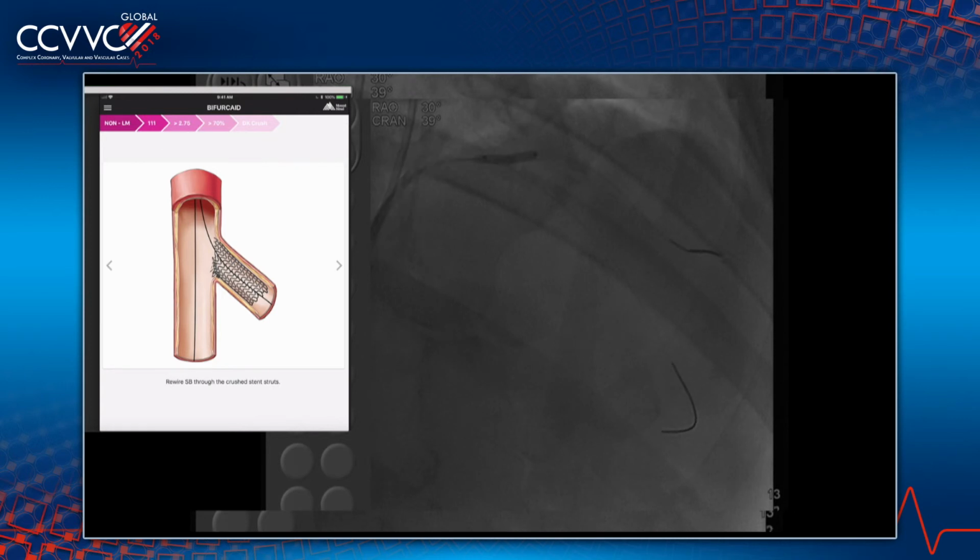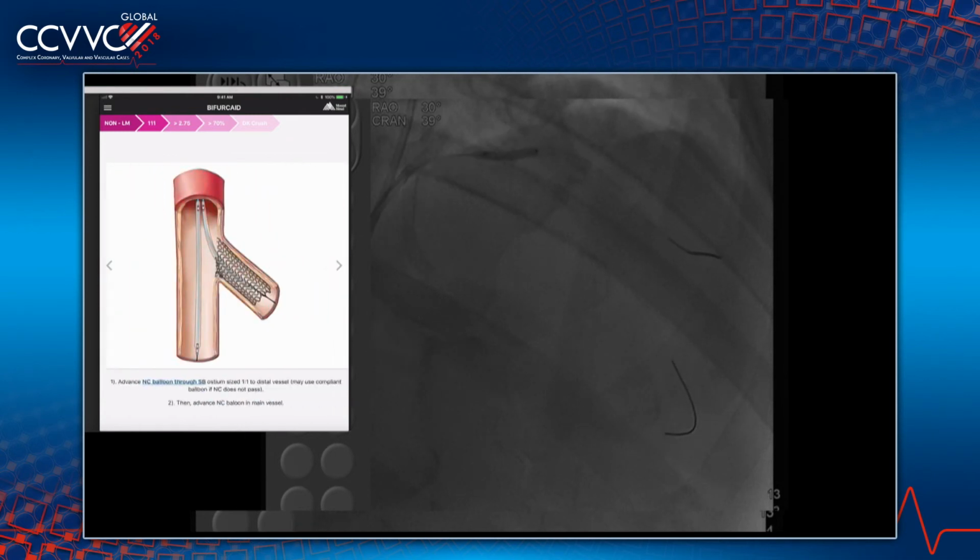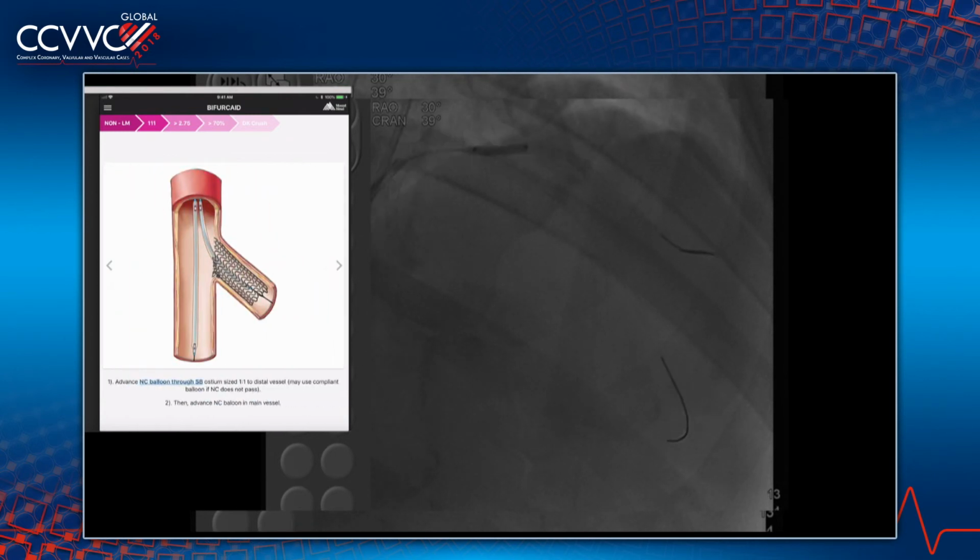So the key issue is you have to do POT at the end. Now we have to kiss, right? Yeah, but at the end, don't forget the POT. I mean, everybody is excited about going to lunch, so make sure you have a POT at the end. Yeah, she will do the POT at the end, but right now you're just opening the side. Now you're gonna kiss.